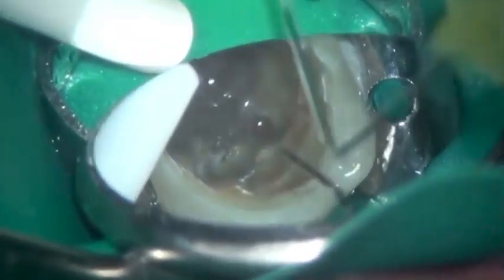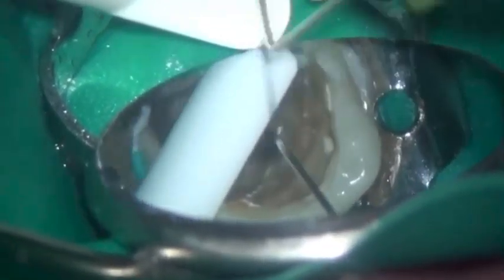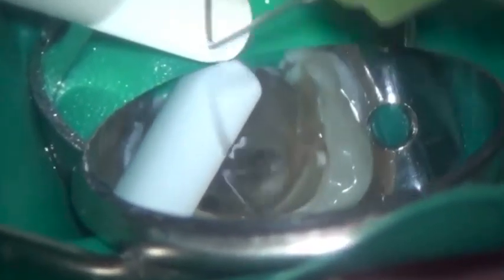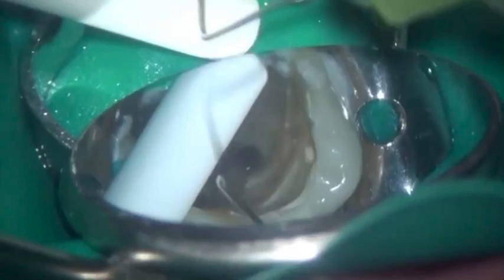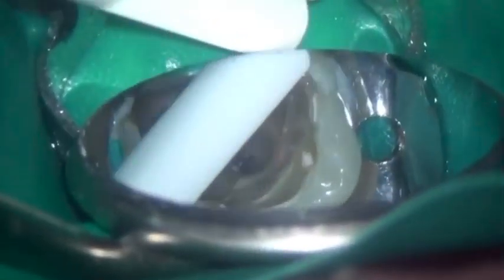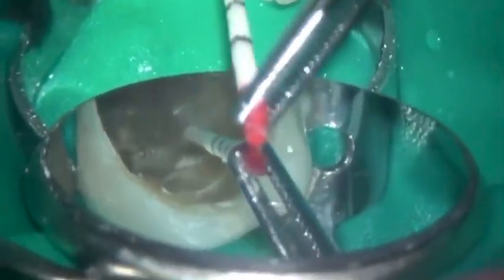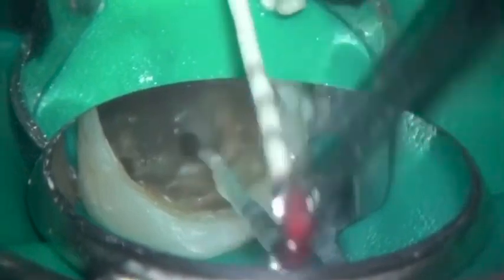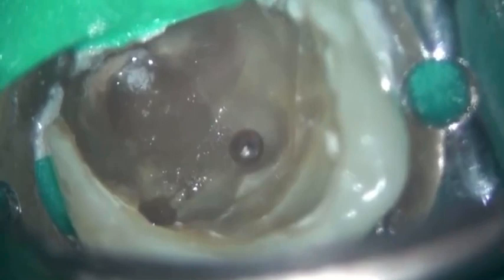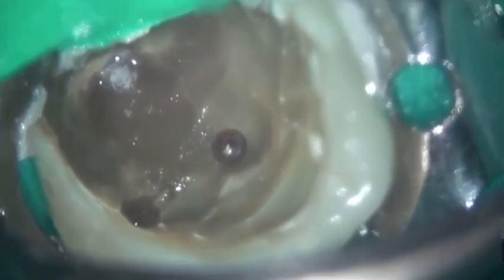Both in a buccolingual and mesiodistal direction. I've removed the temporary restoration and I'm now irrigating the pulp floor and the mesiolingual canal. Once the canal has been dried I can clearly see the head of the instrument under high magnification. Being able to visualize the instrument like this means that retrieval should be much easier.